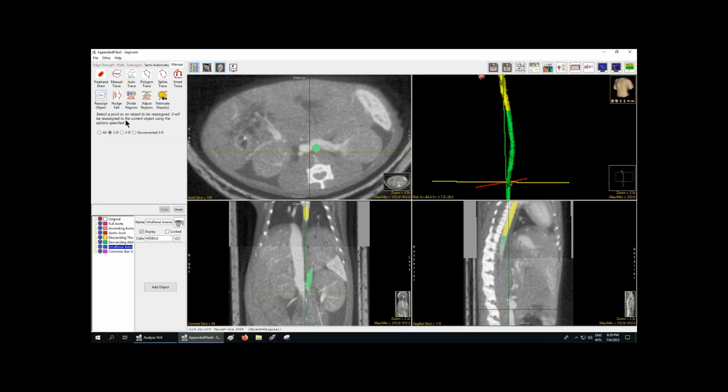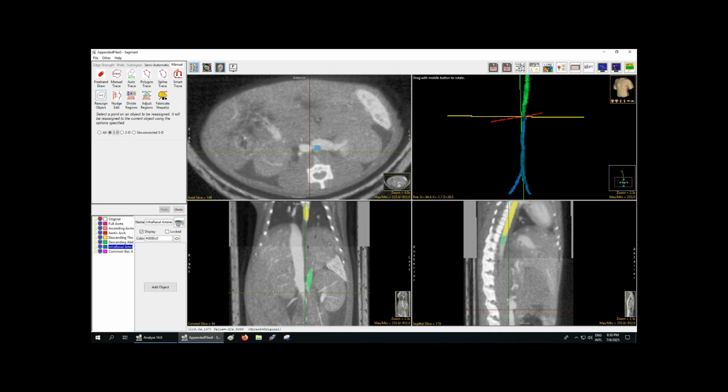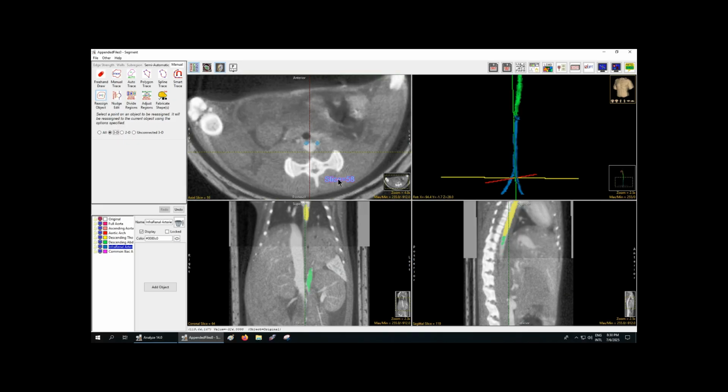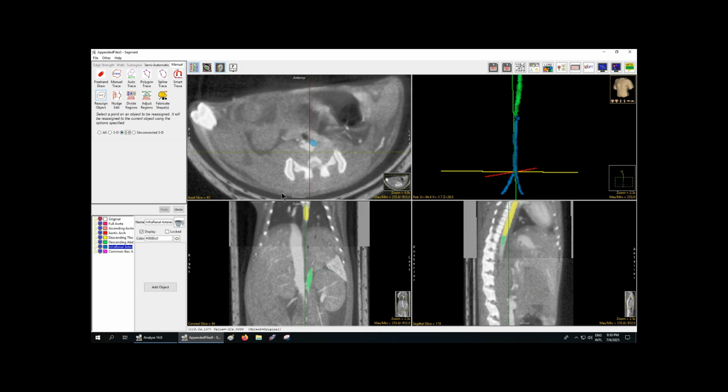We're placing the cut right above that, so again, we're choosing 2D, and selected our infrarenal artery object, choosing that slice, selecting 3D, going one slice below that, and selecting it again, and then the entire object below that becomes part of that infrarenal artery object. Now finally, for the common iliac bifurcation, we find the splitting, and then we just place a cut right above that. Select the slice again, go one slice below that, and there we go. That is how we have split up our entire aorta into different sections.